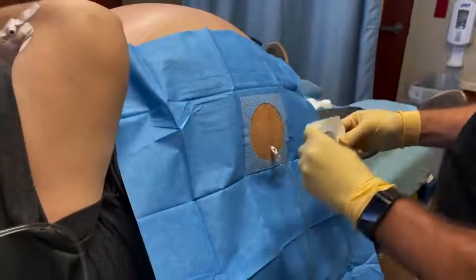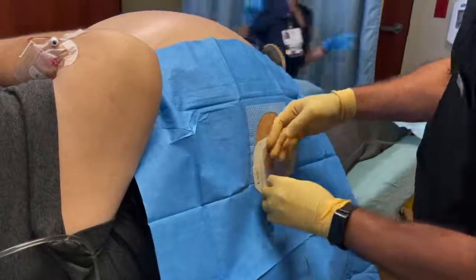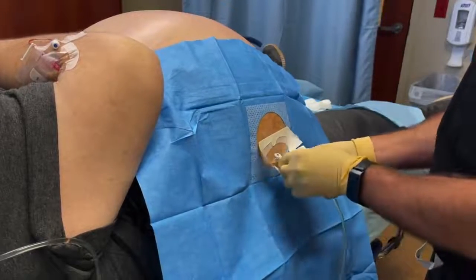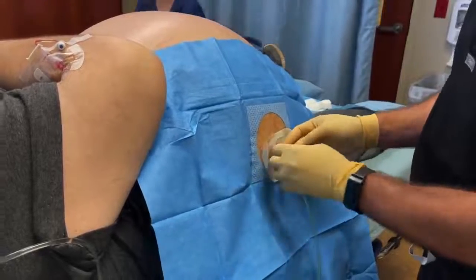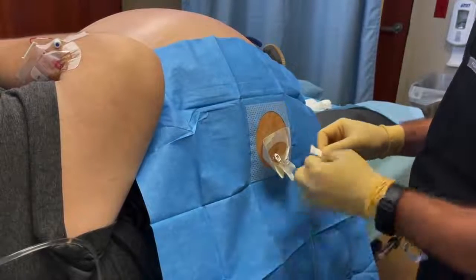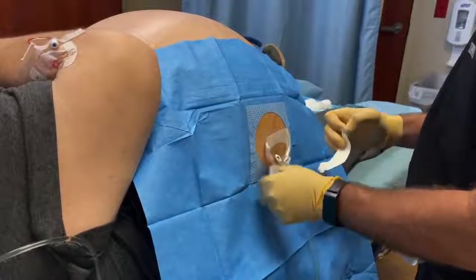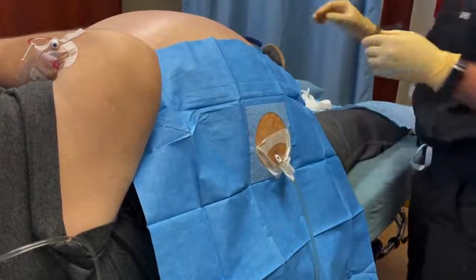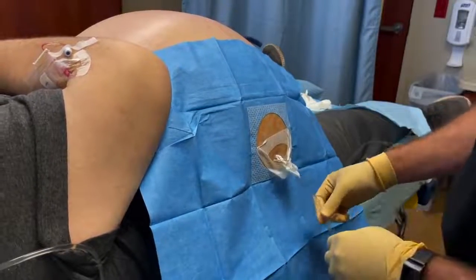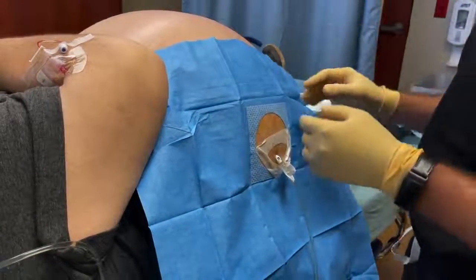And then one thing we do to prevent that from moving and losing it is we take the sticker and we stick it in. Now that kind of kinks it a little bit, so it might slow it down. So I sometimes do that. Normally it drains a lot. It drains pretty quick when they suction it. And that's the procedure. Now it's a matter of changing bucket after bucket until we remove as much as possible.